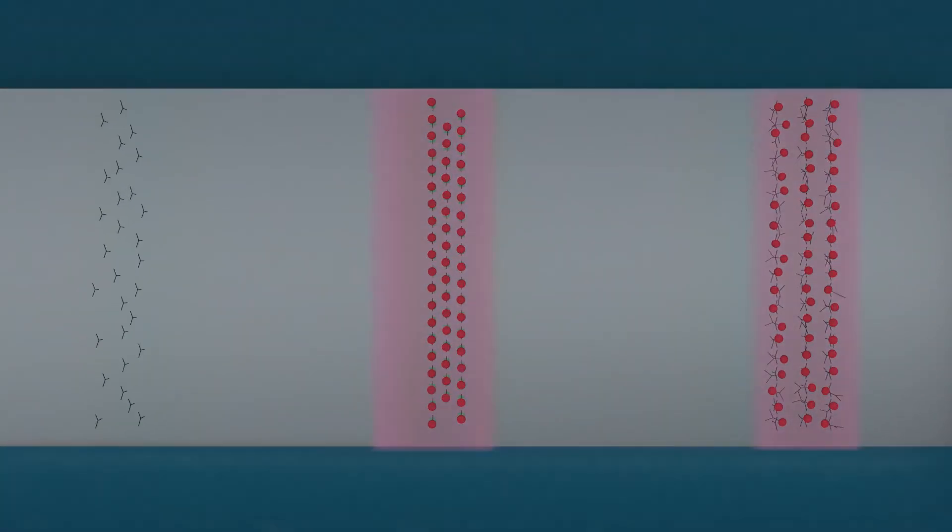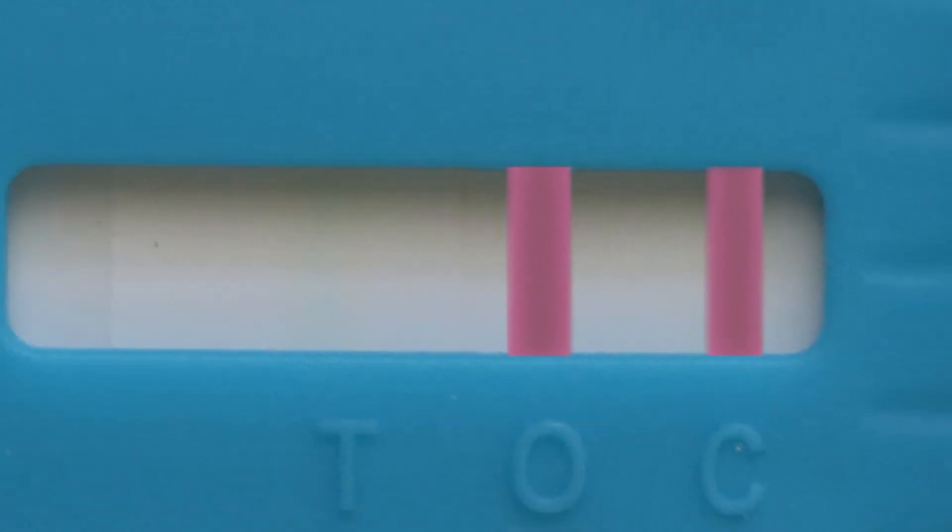That's why, in the case of a negative result, you will only see the control and overload lines develop.